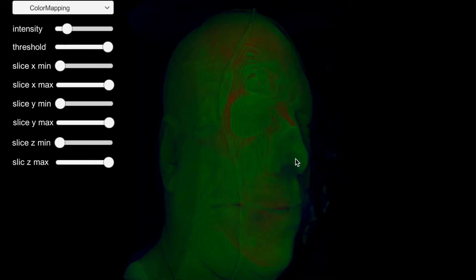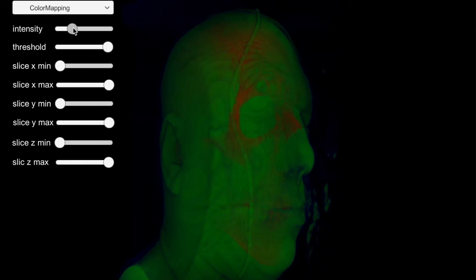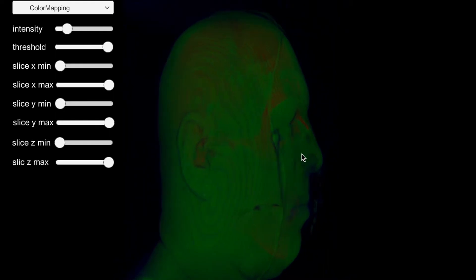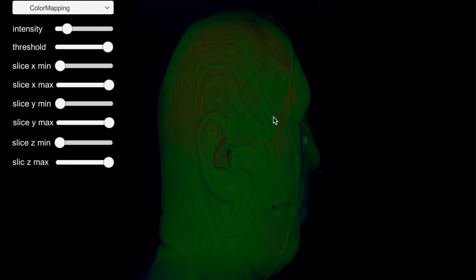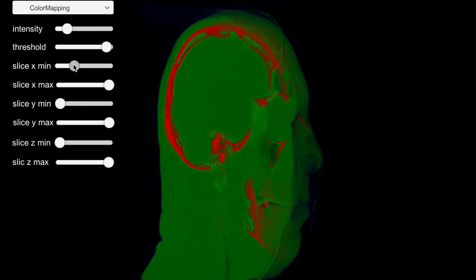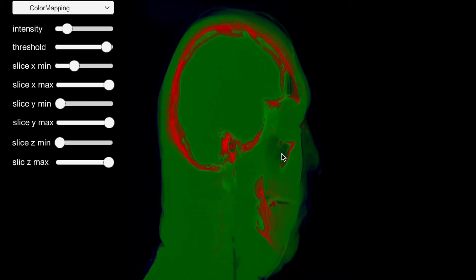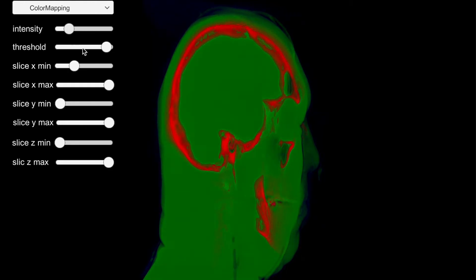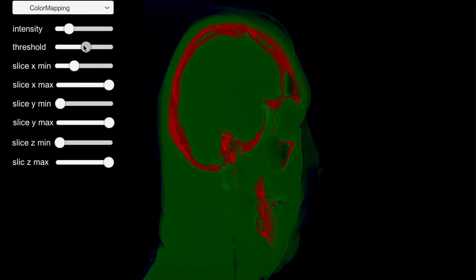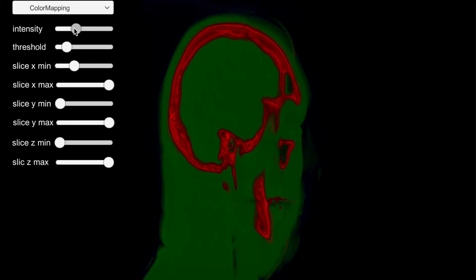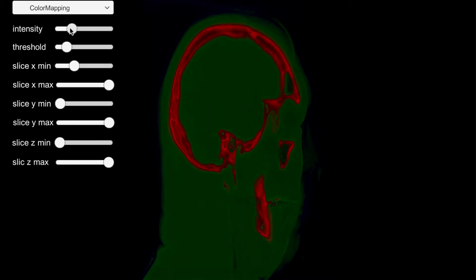That's why we change to the color mapping mode. We map opacity to three hues of colors. Blue represents the lowest voxel value, red the highest, green in the middle. This mode clearly sets apart the soft tissue from the high density red bones.